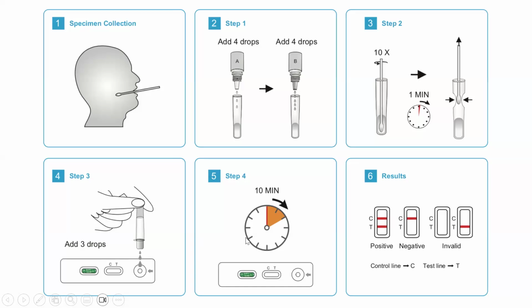Okay, then here we added the sample with the reagents and the throat swab sample, and then we wait for the test to occur. Then we look for the control line, which should be present. See, this test is invalid because we don't have a control line, even though when we added the sample we have a line here, but we discard this sample because we don't have a control. So we always look for a control.